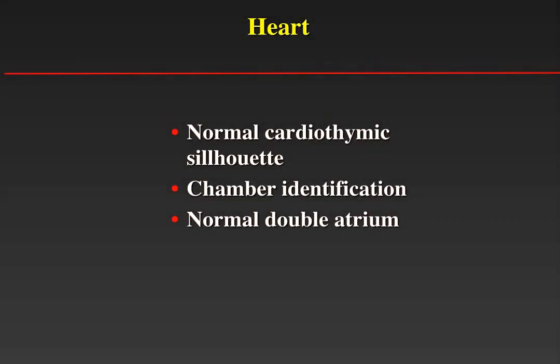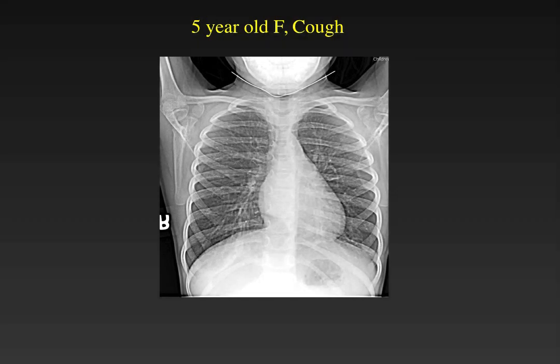When looking at the heart, we have to describe the heart shadow as a cardiothymic silhouette, especially in young children because the thymus can reach all the way down to the diaphragm. It is very difficult to describe specific chamber enlargement in young children because the heart is relatively large in proportion to the chest, and one chamber's enlargement can displace others. In this five-year-old, the left atrium appears as a rounded radio-density behind the heart. In adults this indicates left atrial enlargement, but in children it is an entirely normal appearance.